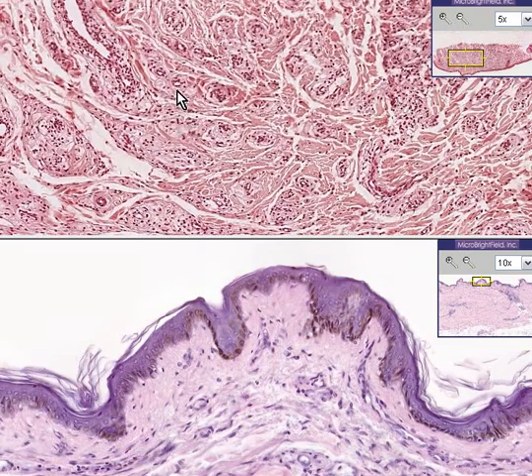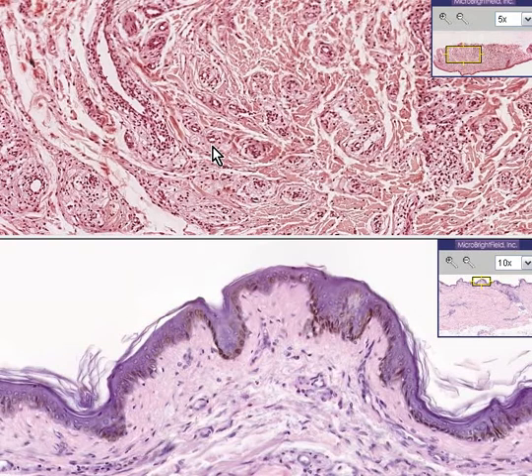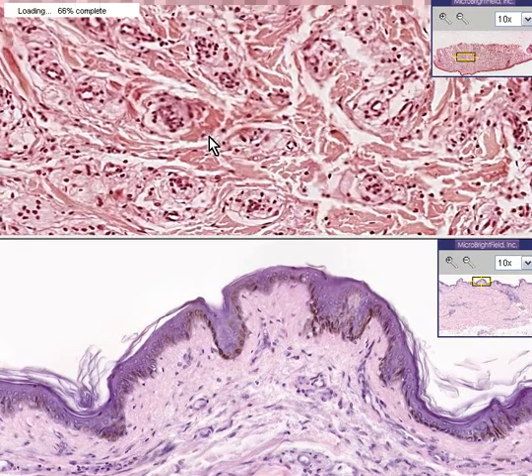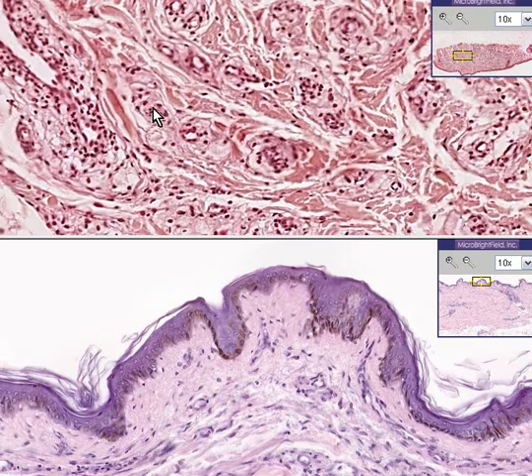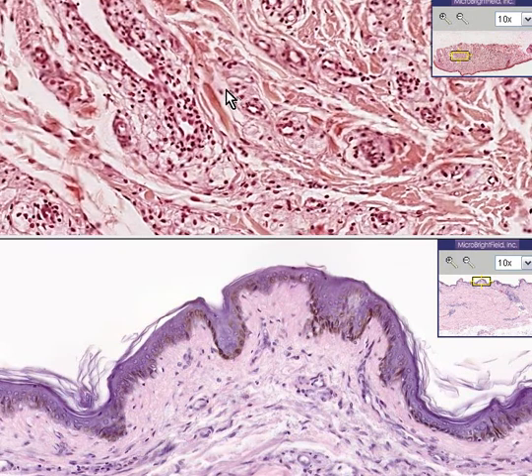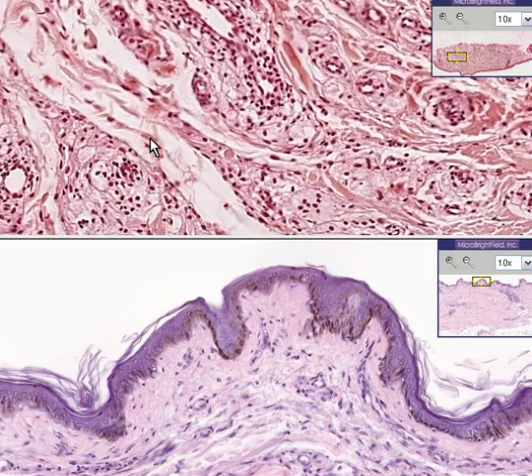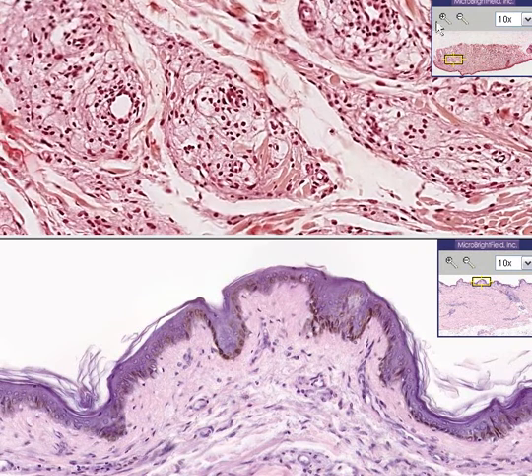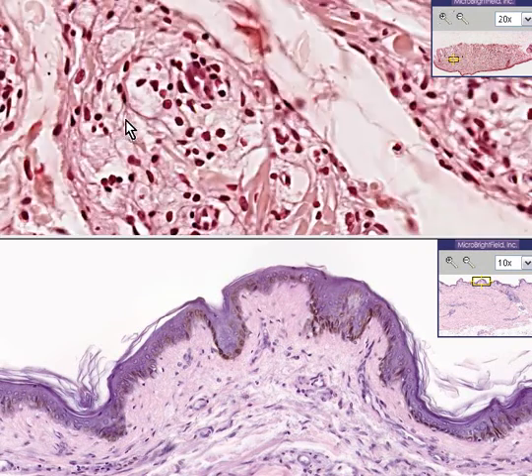It does not have uniform bands of dense fibrous connective tissue. It has these little whirly areas of cells surrounding blood vessels, but also freely little globs of cells in which the cytoplasm is very foamy and filled with some foamy material. These lesions are very, very yellow. That's why they're called xanthoma. I believe xantho is the word for yellow.